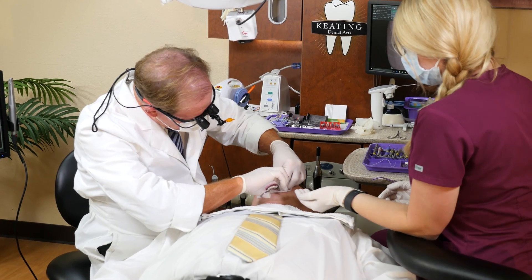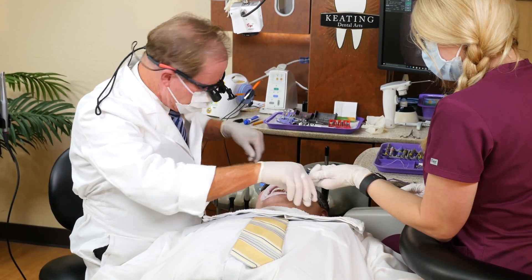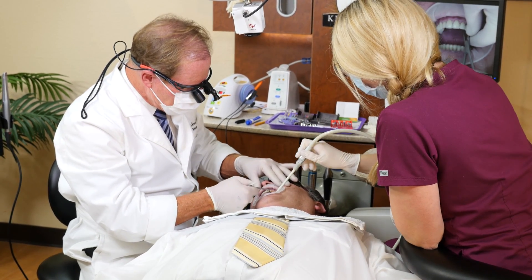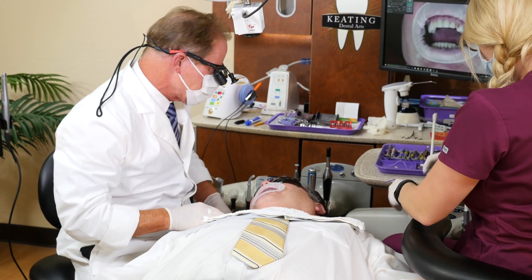I went ahead and anesthetized him a little bit. We'll wiggle off the temporary. We did a great job taking care of the temporary and the tissue looks great.